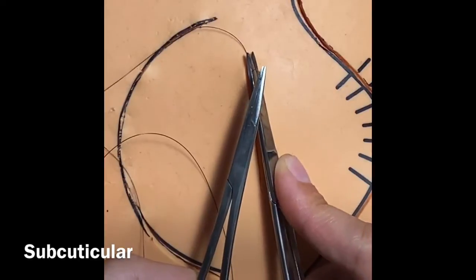With this one, you're only going to cut the tail. Hold up your tail like I showed you how to cut before. You're going to open your scissors a little bit, slide all the way down the suture until you can feel the knot, turn 45 degrees, and cut.